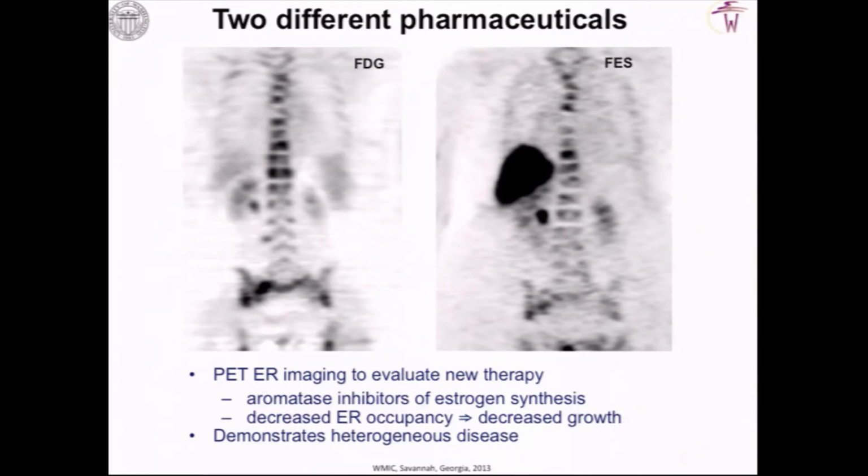Another situation where having two images gives you more than just adding two images together is when you're using two different radiopharmaceuticals. Here's again PET imaging, of the same patient. One is using FDG, which is a glucose analog, and it shows us where there's tumor activity, because tumors tend to have higher energy demands and take up the FDG more.